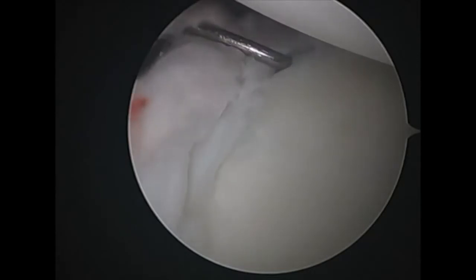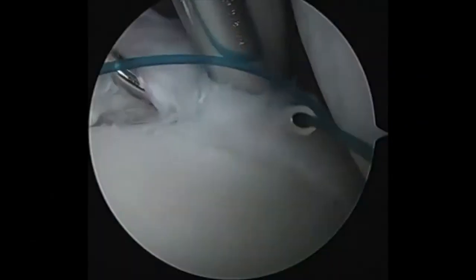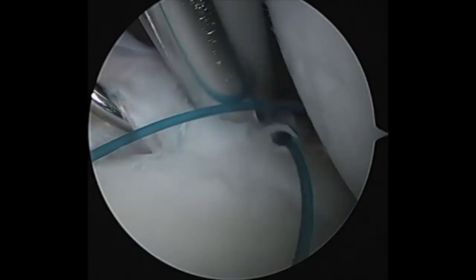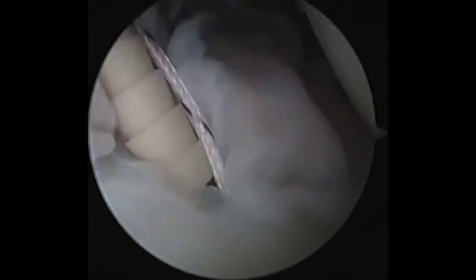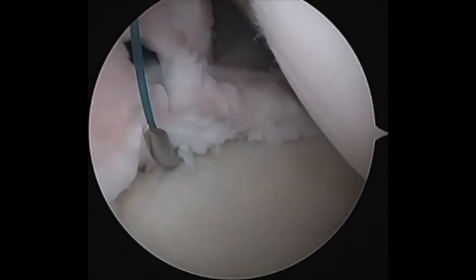Now I have switched portals to look posteriorly from the anterior portal. I again use the Reel Pass to repair the posterior labrum, shuttle suture, and then impact the PushLock. Repeat it one final time, drill the pilot hole, and then impact the PushLock in.